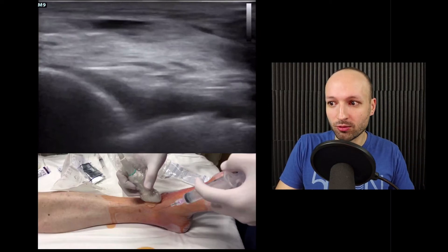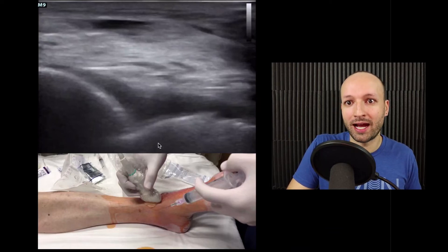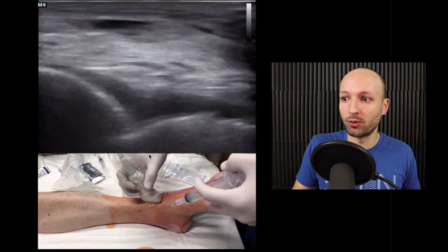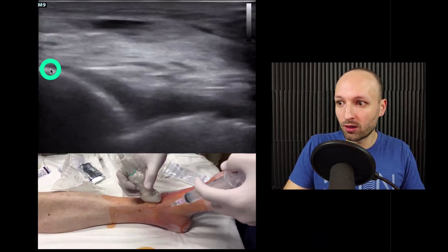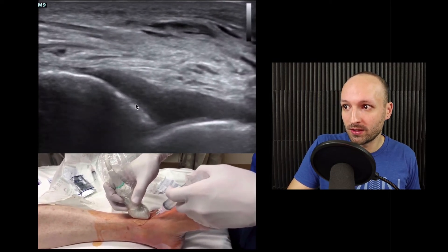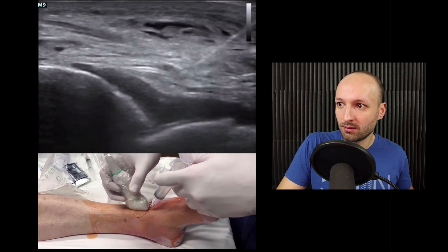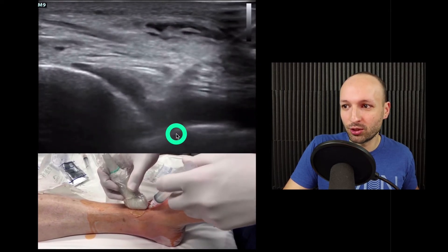Here's an example of doing one on a patient with probe placement. When I'm doing these I'm generally full sterile — not gown and cap, but sterile gloves and a transducer sheath cover — because I don't want to accidentally introduce anything into the joint space. Here is the tibia and this is the talus, and you can see it's very easy to get visualization of that relatively small effusion to tap with ultrasound. I'm poking right there, increasing my angle, and you'll be able to see the needle come into view.